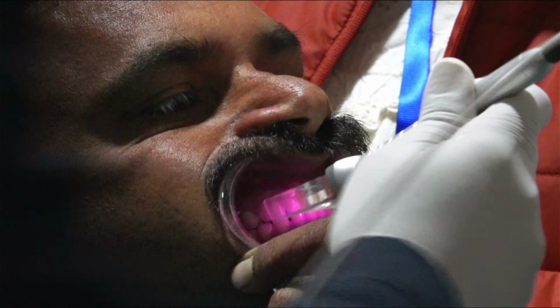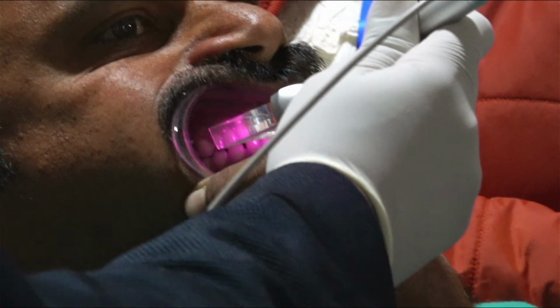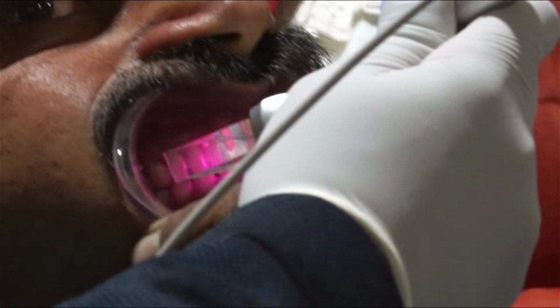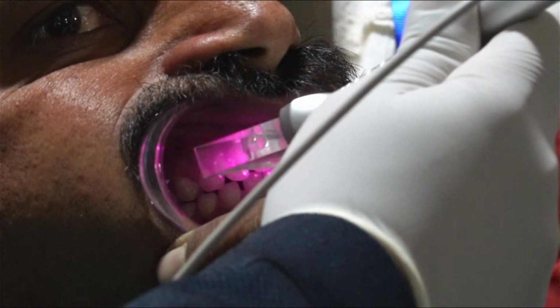So see my laser energy where it is. I am not pointing it towards your eyes, right? This has to be taken care of. Light off, because it is in an infrared zone. You are not going to see it. What you are seeing is the guiding light. That is not the laser light. It's a guiding light exactly where your laser should be. Where it is in 640 nanometers to 660, it is a visible range. There is no need of guiding light.